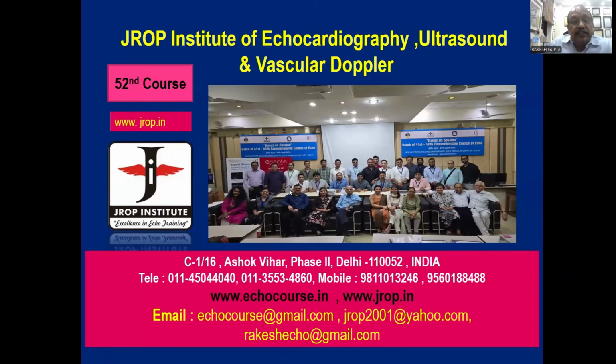Moving out from the infancy and moving on to the application of these M-mode, 2D, and Dopplers, we are going to talk about stenotic lesions today.